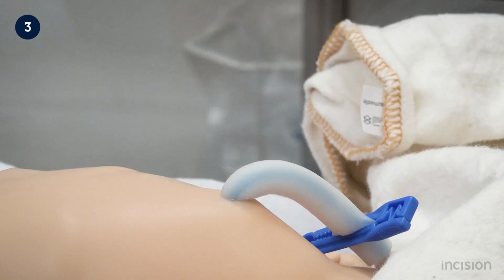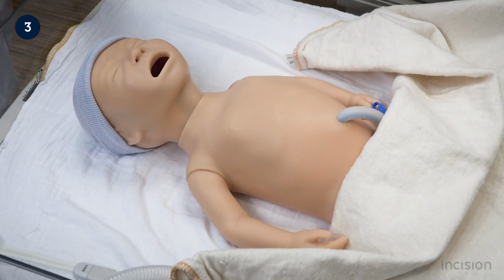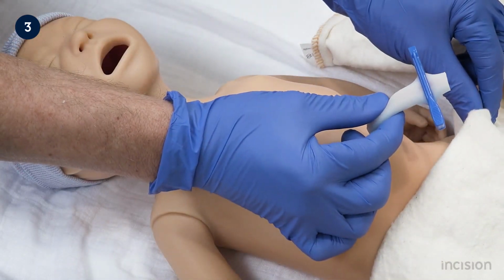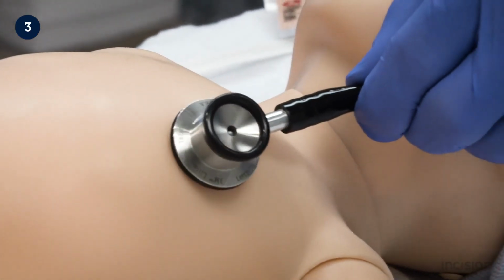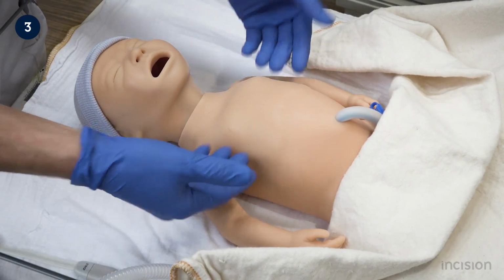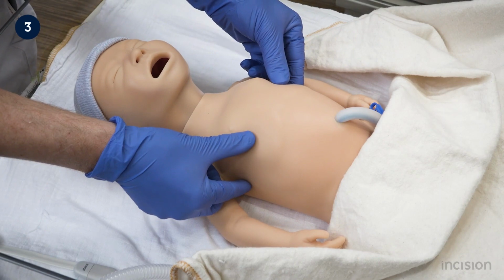Heart rate is measured either by using an oxygen saturation probe, umbilical cord palpation, or auscultation of the heart using a stethoscope. Palpating the umbilical cord is less reliable with a heart rate under 100 beats per minute. Therefore, newborn heart rate is best assessed using a stethoscope. After assessing the skin color, tone, and heart rate of the newborn, breathing is assessed by looking for movements of the thorax, crying, or gasping.